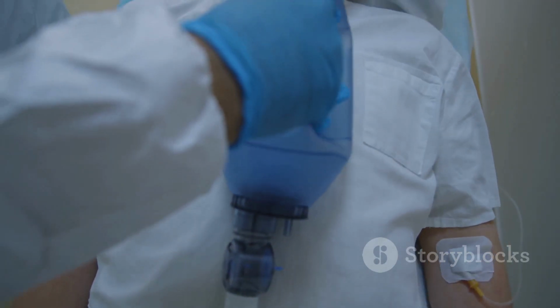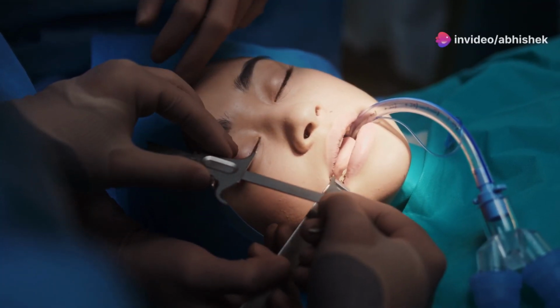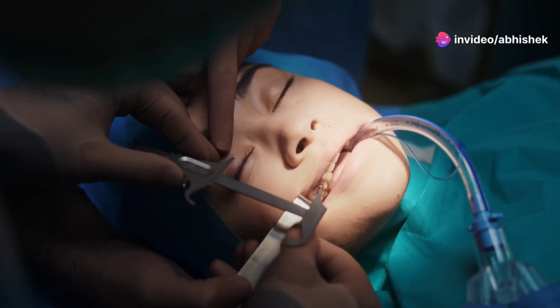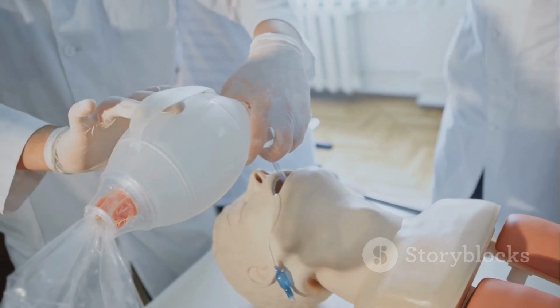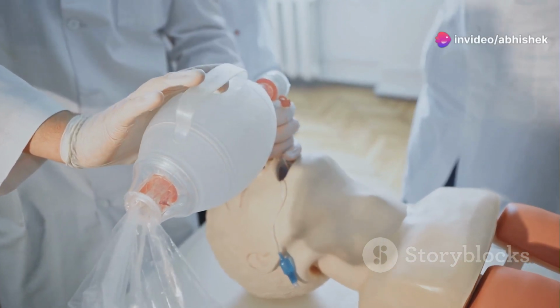A key part of the breathing circuit is the Y piece. This is the part that connects to the patient either through a face mask at the beginning of anesthesia or an endotracheal tube once the patient is asleep. Endotracheal tubes are flexible tubes that go down the windpipe and ensure the airway stays open during surgery.